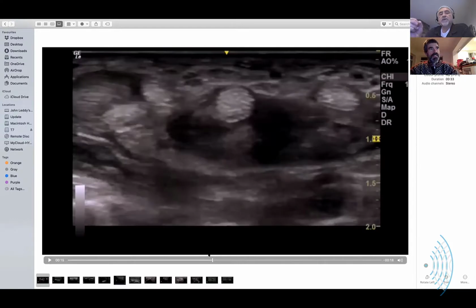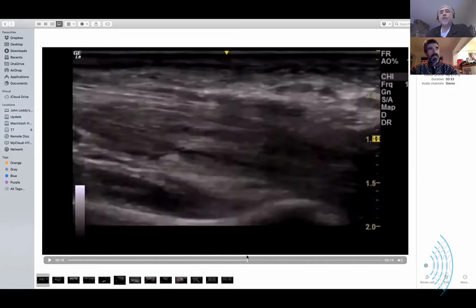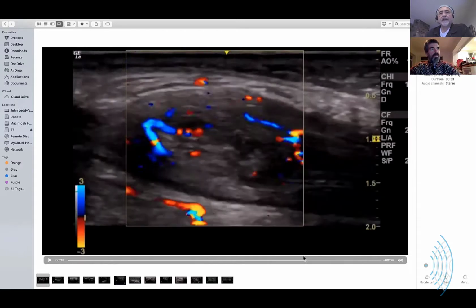Are you also quite happy with the sensitivity of your color Doppler in that, or would you say I'm using a standard imaging tool, so any decent machine would show it that brilliantly? No, you have to make sure that your gain and your pulse repetition frequency, your scale, are set appropriately, and that's machine by machine.